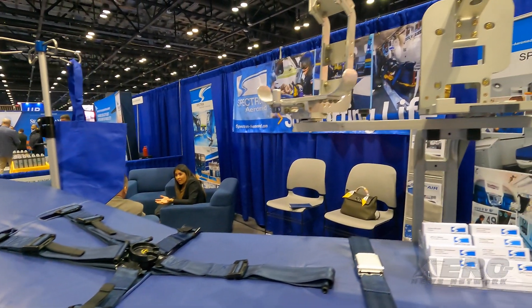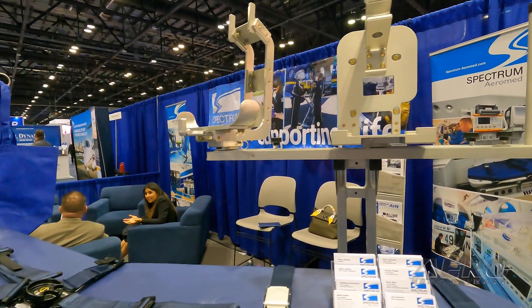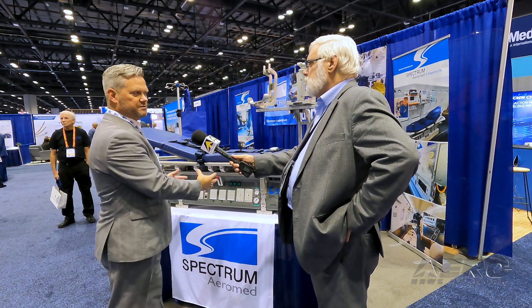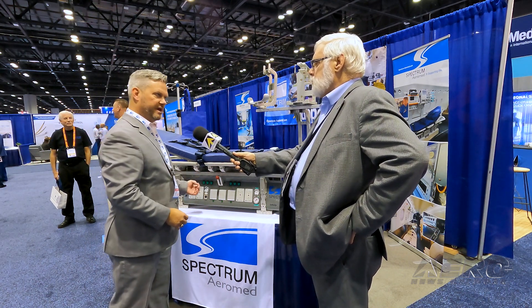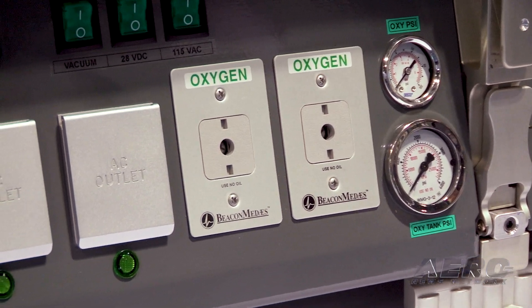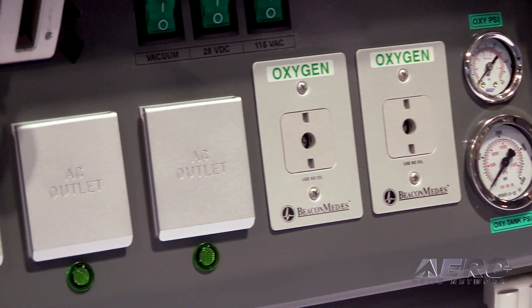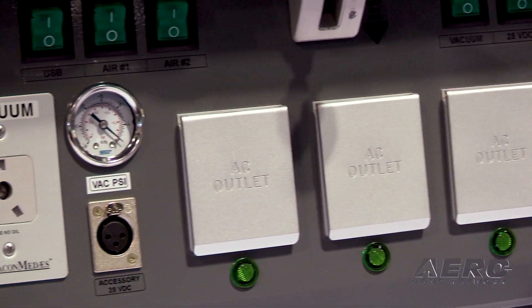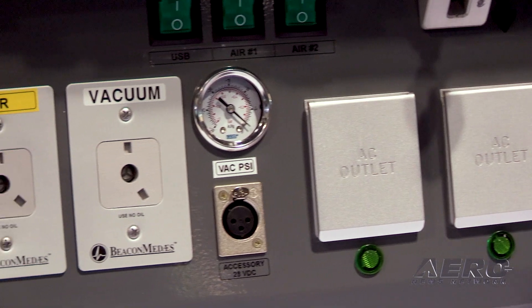We have a solid fit to the aircraft floor with our locking feature on the bottom of the module, and then everything else is right here for that medical team to work with. You have your oxygen gauges, your vacuum gauges, your air gauges as they're operating the equipment and monitoring that patient — we've kept everything at a very easy-to-see, reachable position on the front of the system.